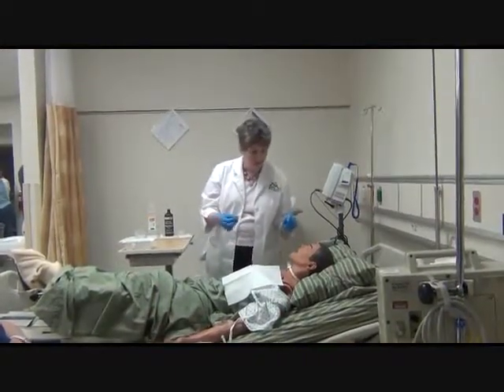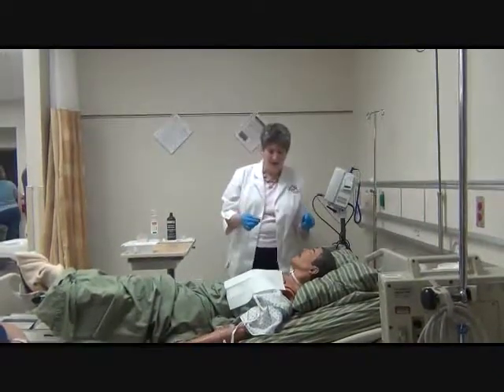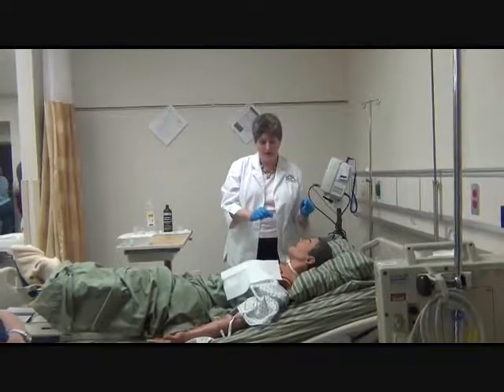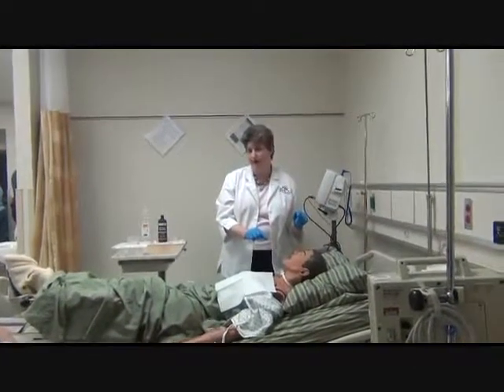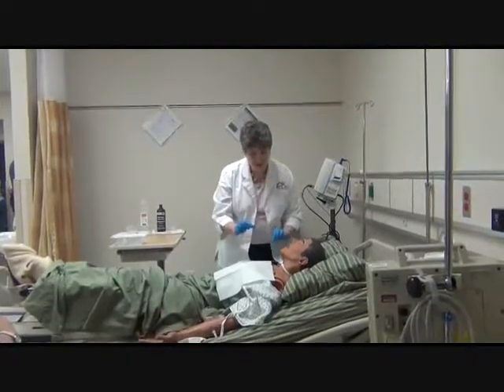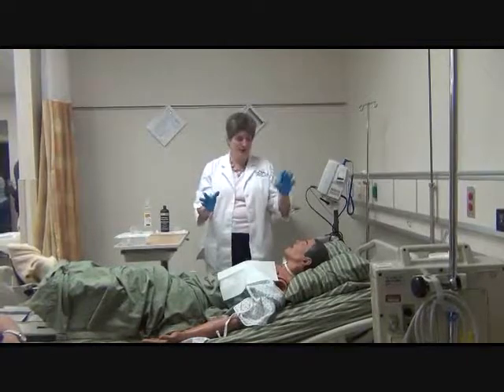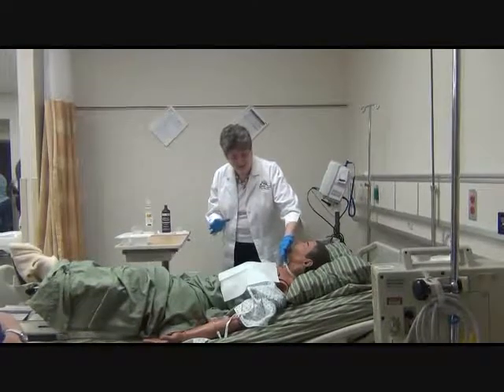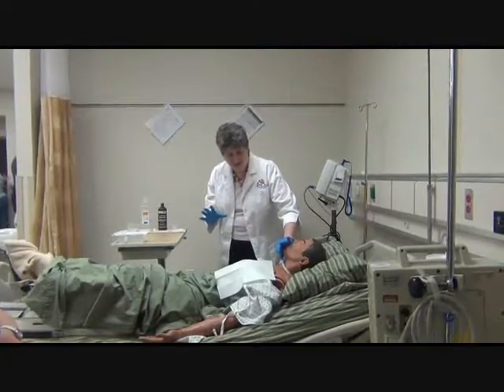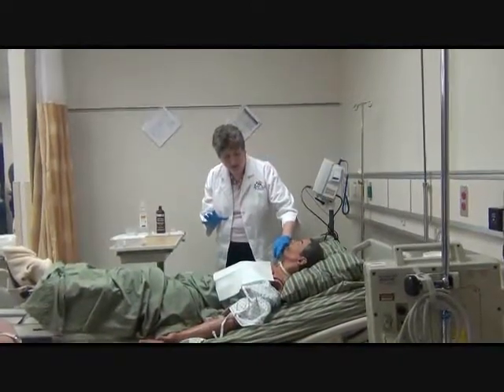Okay. At this point, there are two ways we can go about this. If your patient has a lot of thick, hard secretions on this inner cannula, it may need to soak for a little while you do your care. So I'm going to, again, decide which hand I want to be the cleanest and which one is going to be dirty. And this is going to remove the trach.